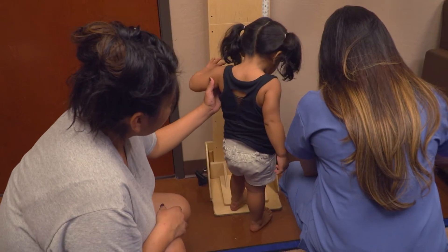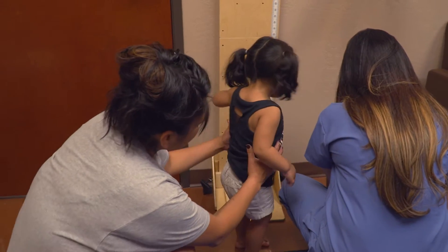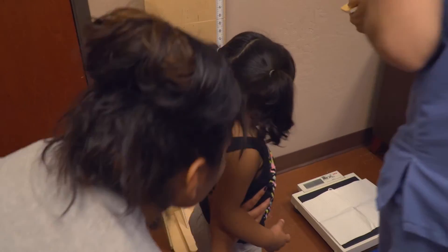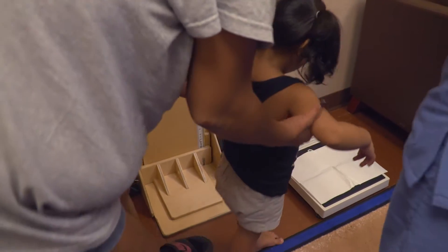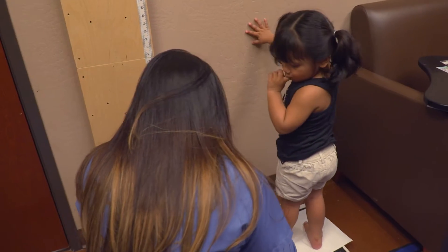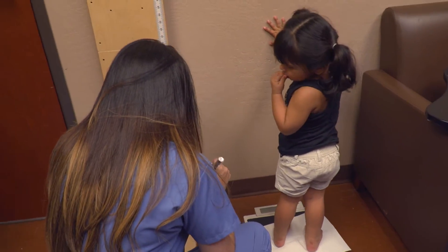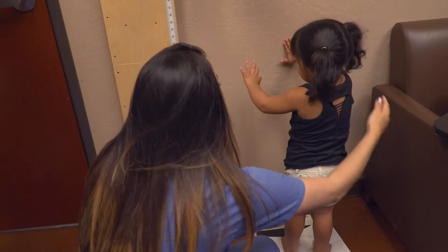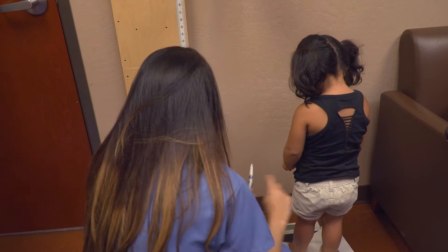Let's see, your turn, sweetie. Okay, we're going to go ahead and have her step on the middle of that scale if that's okay. Stay right there, don't move, okay? All right, you're doing awesome. Okay, sweetie, can you put your hand down? Down, down, to your side. All right. Okay, all done. Come here.